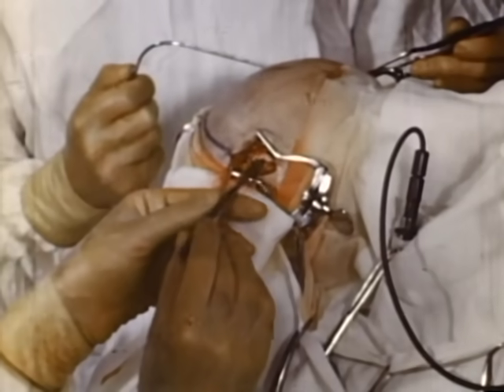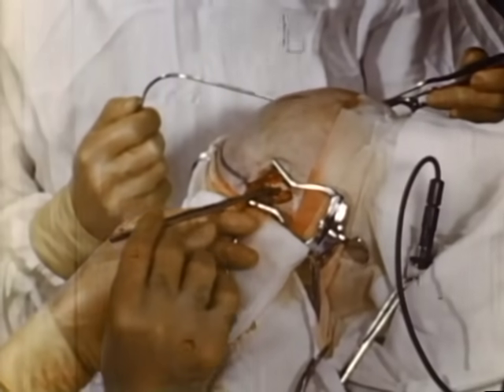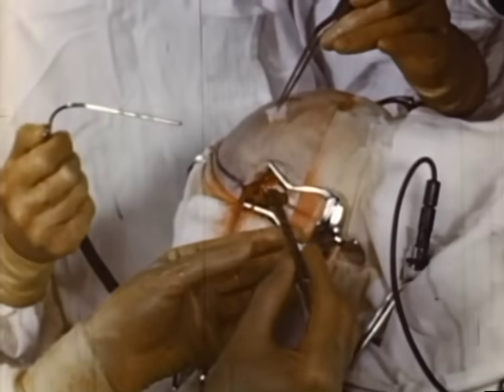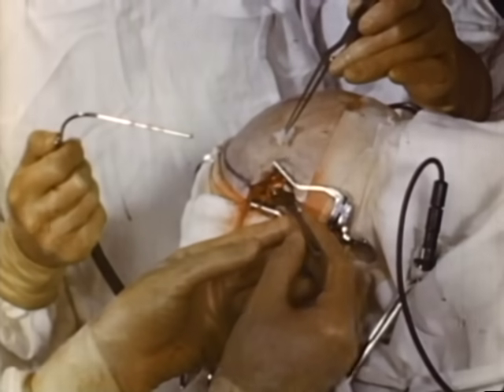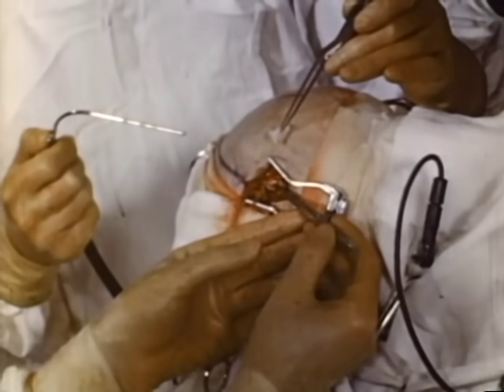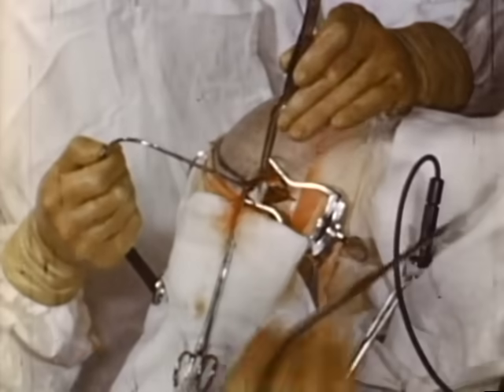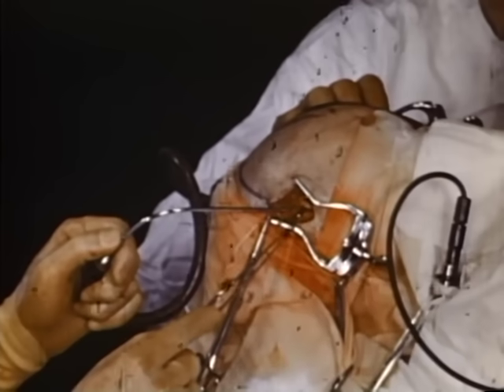The incisions are now deepened by radial stab incisions which push the vessels before them, preventing further bleeding, and at the same time interrupting more completely the fibers in the frontal lobe. It is when these remaining fibers are being severed that the patient often becomes disoriented. The surgeon starts on the second side, inserting the leucotome through the incision where it can be seen coming out on the surface of the brain. This shows the delicacy and accuracy of the method.